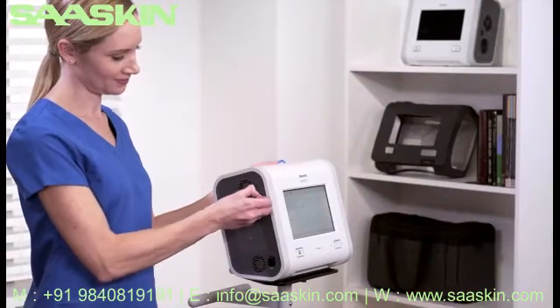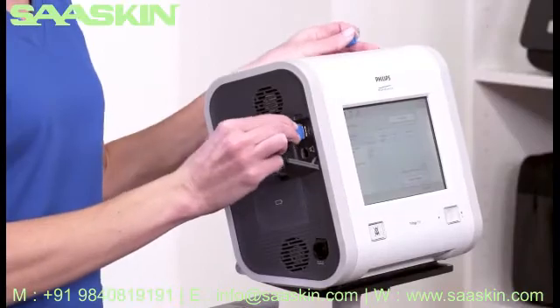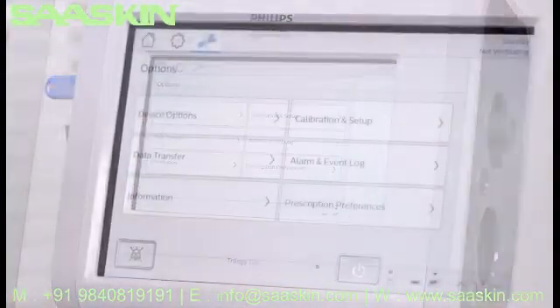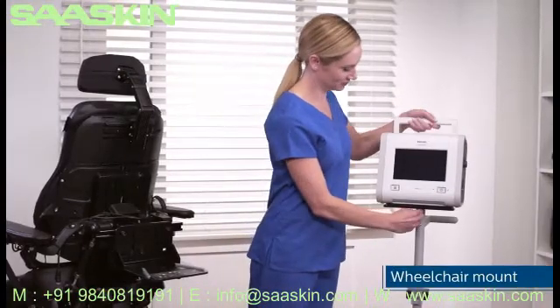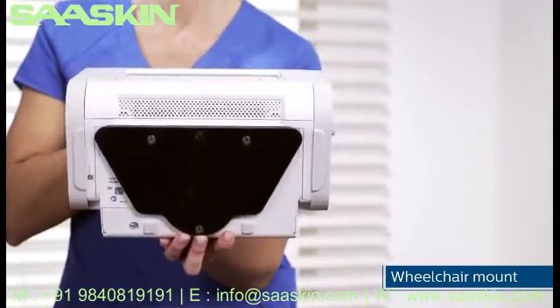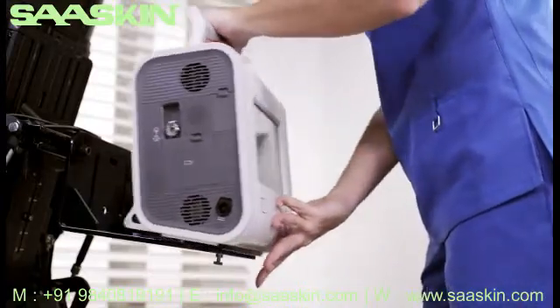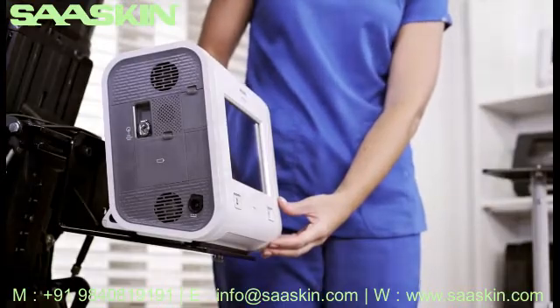The USB port is also used with a USB stick for data downloads and software updates, accessible via Options and then Data Transfer. For patient mobility, the device can be easily and securely attached to a wheelchair using the same attachment plate as the roll stand. These and other accessories make Trilogy EVO versatile and convenient for clinical use.